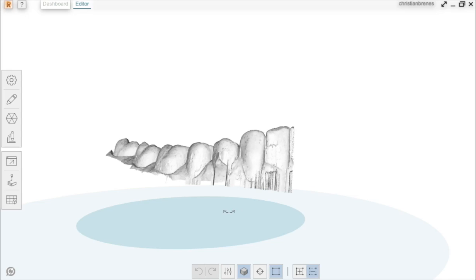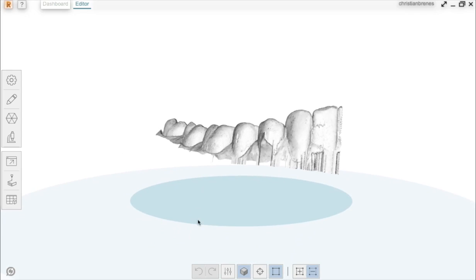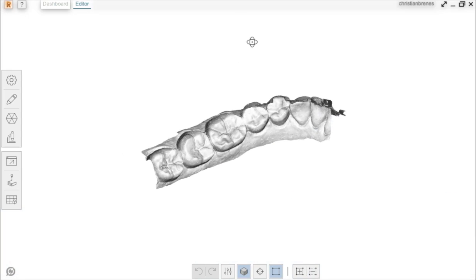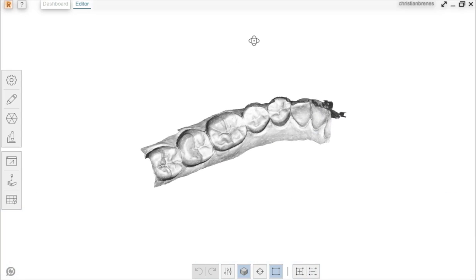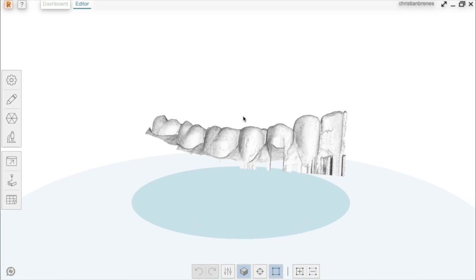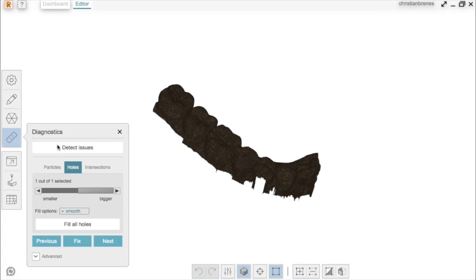Every model that is scanned with a lab or internal scanner is open at the base, and you need to close it if you want to print it. It is always recommended to run some kind of diagnostics to fill holes or get rid of any loose particles and make a cleaner model before you print it.